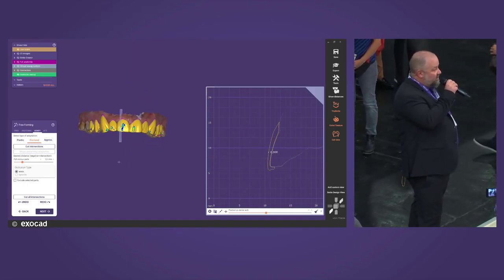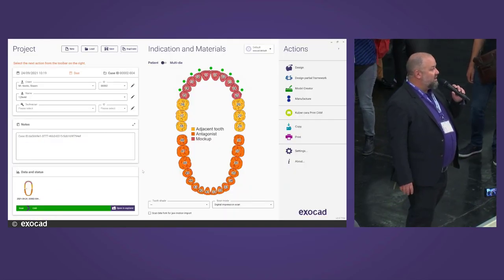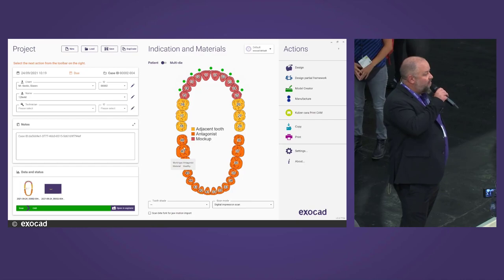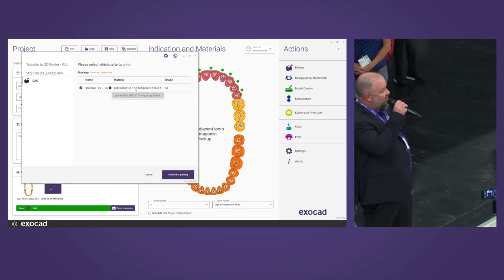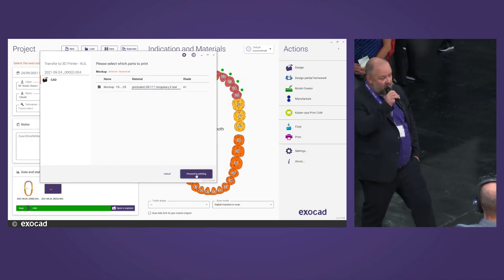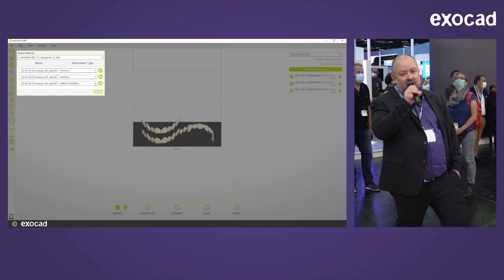That's the final result. Now at the last step, you can decide to start printing, or continue to do the model. We go back to the DentalDB, click on the integrated printer — just one click — and exoprint will start. The case appears in exoprint, you click to proceed to printing, and automatically the printer software is launched. It comes from the printer manufacturer but works similarly, with a wizard guiding you through every step. It's really easy to use.